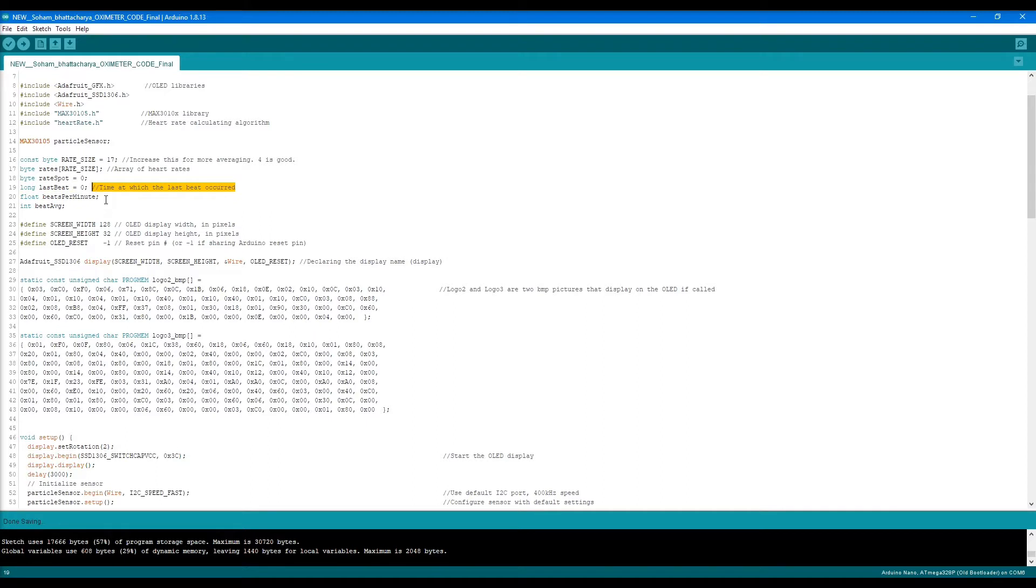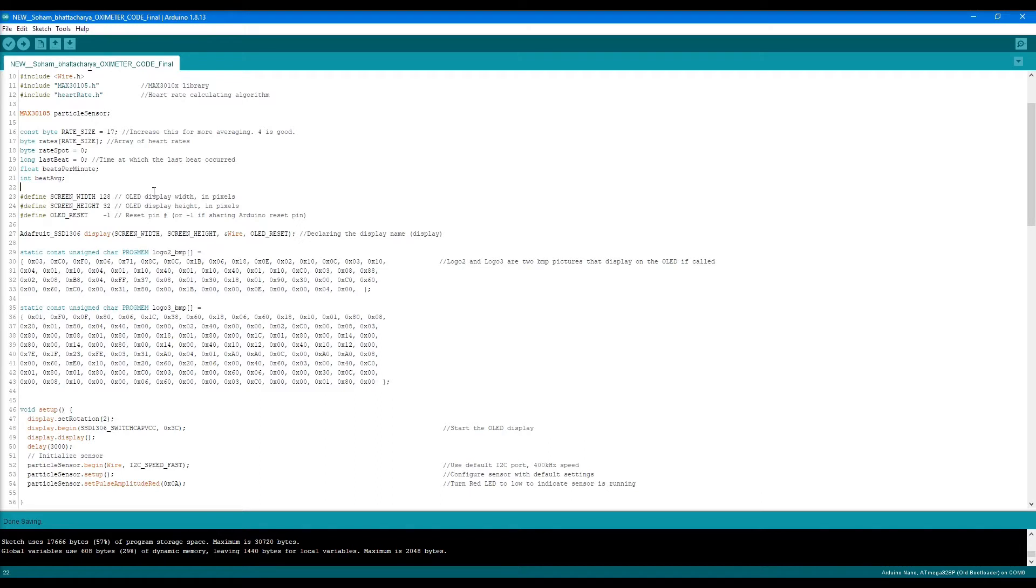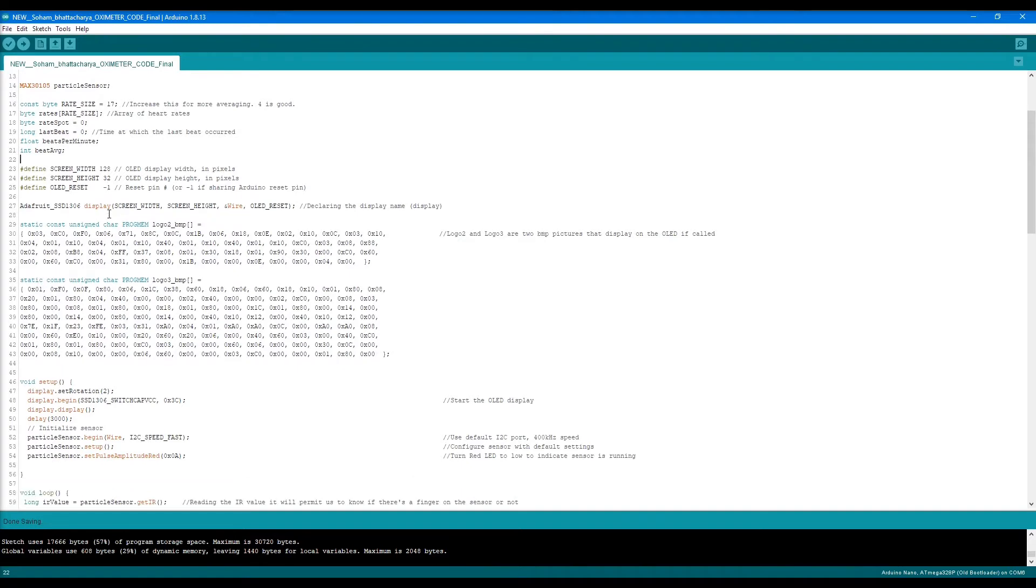These are a few more variables required. From line 23 to 24 are the OLED display width and height according to the pixel. This can be anything according to the size of the OLED screen you're working with. If your OLED display breakout board has a reset pin, it can be that number. If it's sharing the reset pin, I recommend this, so it's minus one.